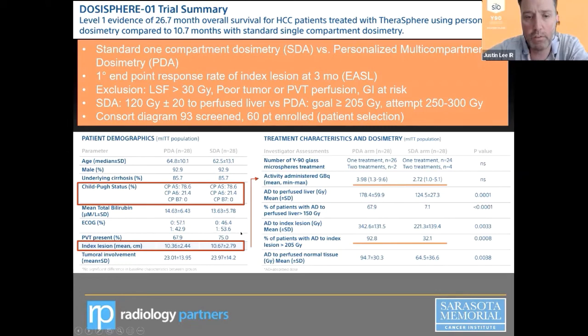If you look at the activities, they are very high. You can achieve very high activities per vial if you use them early in the decay of a glass vial, but then you may be losing the number of particles that you need to address a tumor that's 10 centimeters. So my guess is that multiple vials were used.